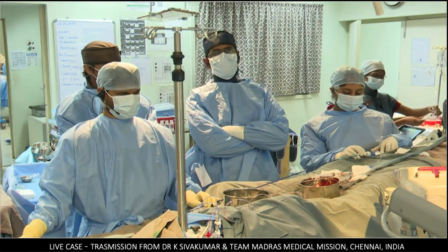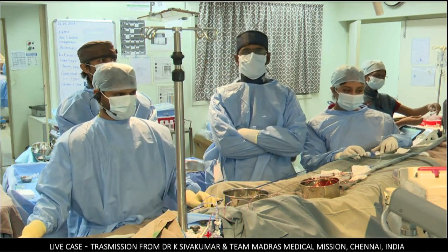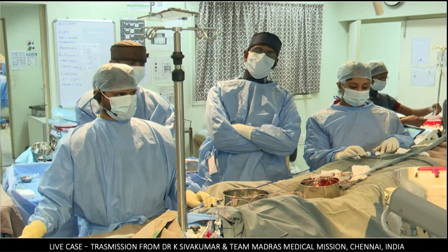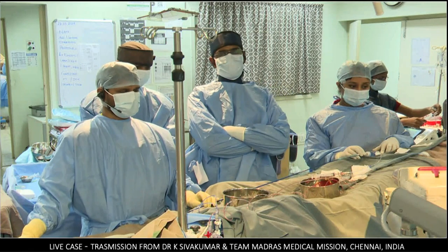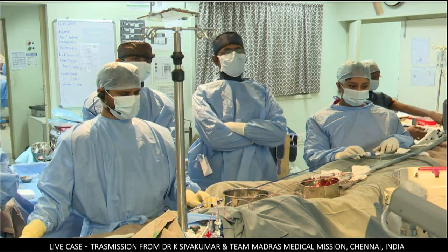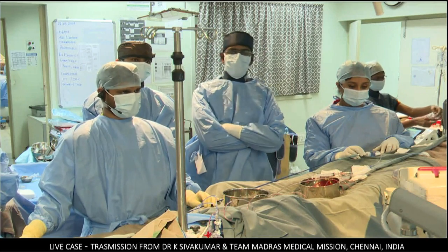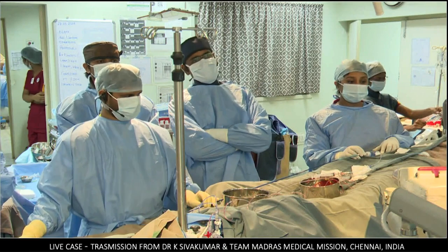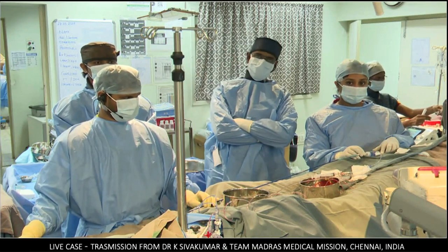There was an onset of RV dysfunction on the MRI with ejection fractions falling down. The pulmonary regurgitation fraction was more than 65%. The patient was increasingly becoming symptomatic and is having a possibility of an impending pregnancy in the near future. So we decided to go for a valve implantation.